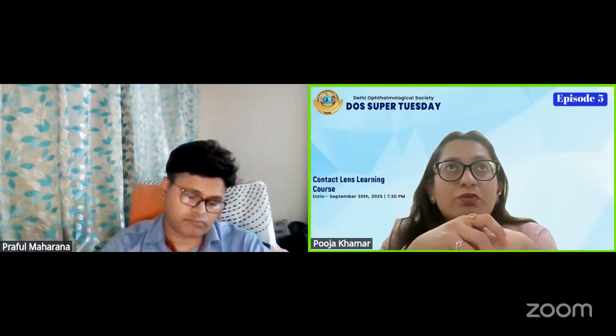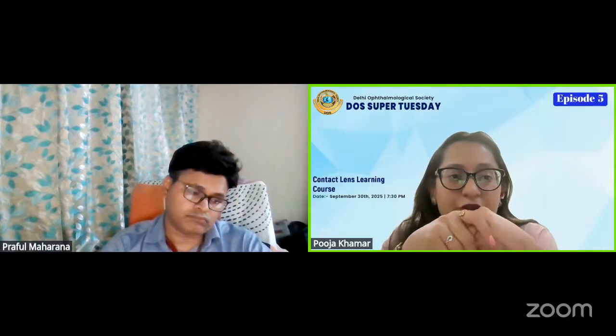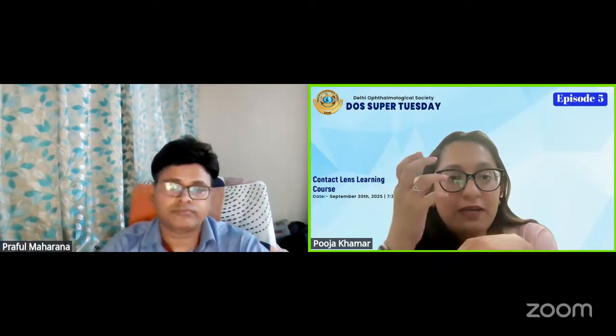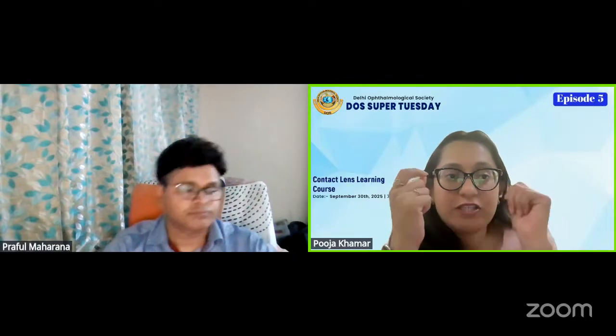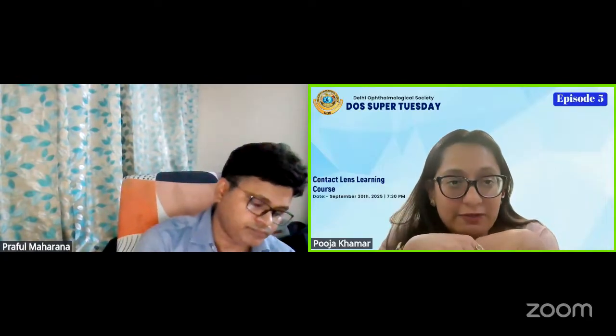It comes to almost 25 to 30,000 rupees. So if you have to ask the patient to do it again and again, it may not be very suitable. And also, I think now the company doesn't manufacture it anymore. So LipiFlow was the gold standard, but it has its limitations. IPL works very well, but IPL is not a thermal pulsation therapy. It's just a pulse based therapy. It doesn't produce heat on the lids, and it activates your parasympathetic system.